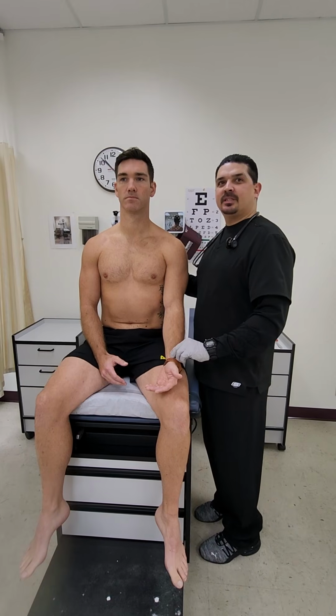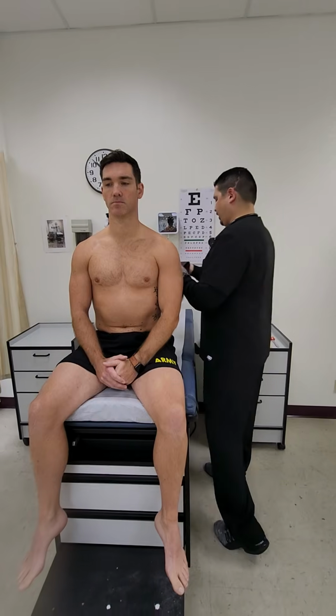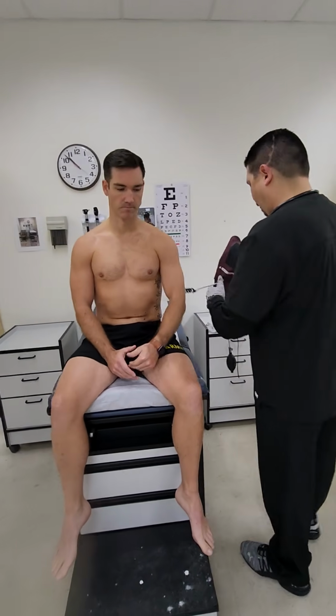Okay, pulse is 62 and respirations are 14. Now we're going to check the blood pressure. Okay.